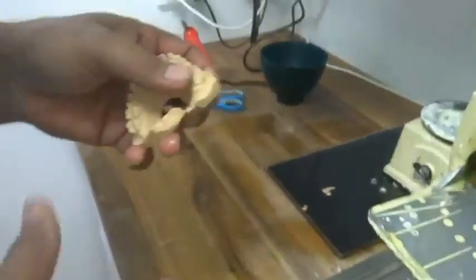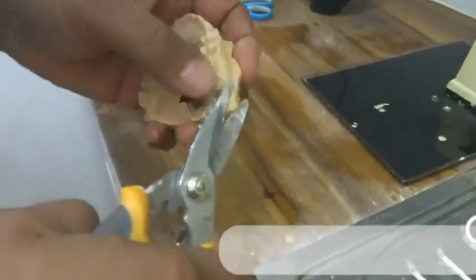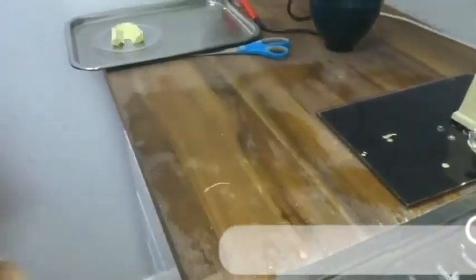A little bit more trimming to do just there. Sometimes I would just use a plaster trimming tool just to get rid of excess. Okay, so that's ready to go.